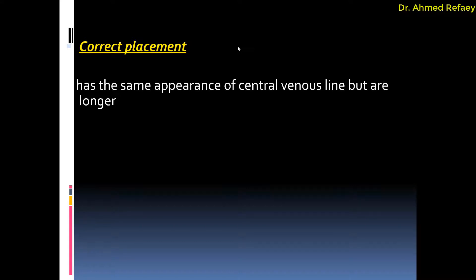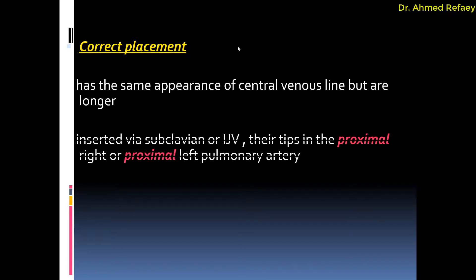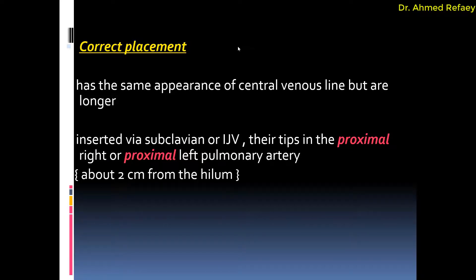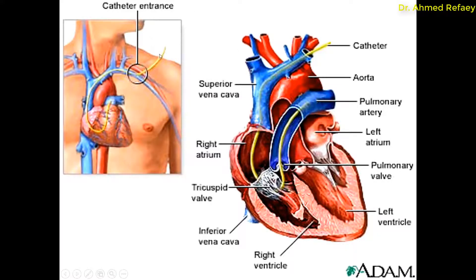Regarding correct placement of a Swan-Ganz or pulmonary artery catheter: it has the same appearance as a central venous line but is longer. The catheter passes through the right atrium and through the right ventricle, and the tip is located either in the proximal right or proximal left pulmonary artery, about two centimeters from the hilum. As you see in this image, the catheter is inserted through the left subclavian vein, going to the left brachiocephalic vein, superior vena cava, right atrium, through the tricuspid valve to the right ventricle, then to the pulmonary trunk, with its tip in the proximal part of the left pulmonary artery.